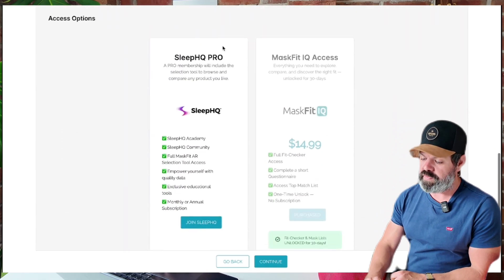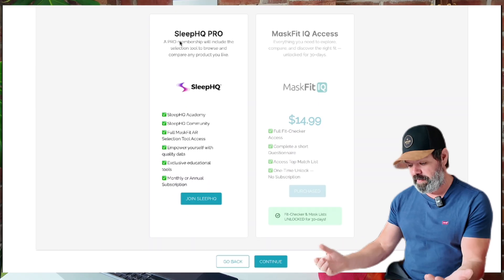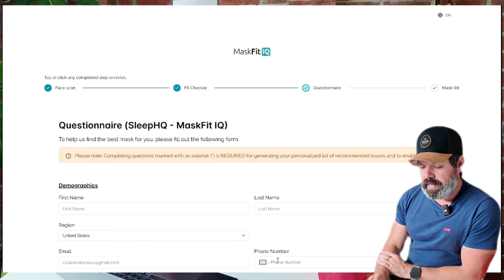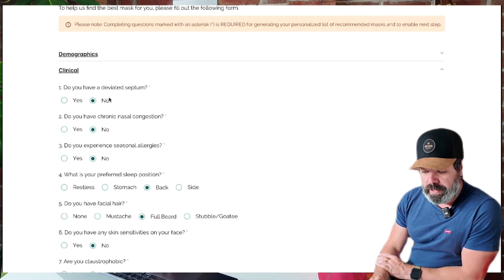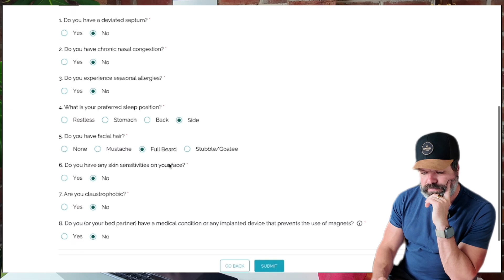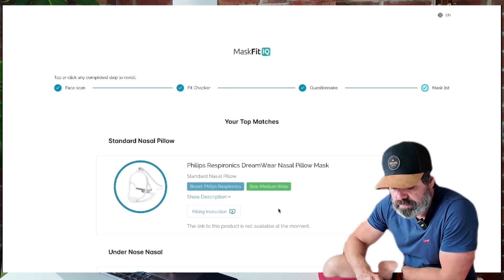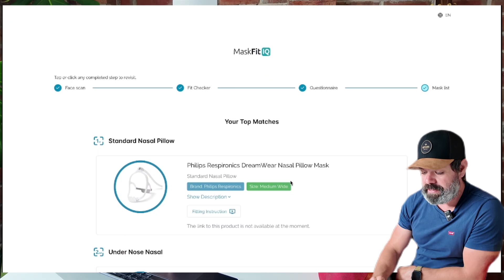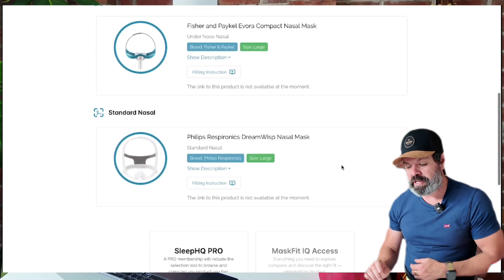If we scroll down, you can see mask fit IQ access is normally $15 for 30 days, but with a Sleep HQ Pro membership you get unlimited access forever. I'll tap continue. I can fill out a questionnaire here — do I have chronic nasal congestion? No. I sleep on my side. Full beard? No. I'll click submit. And here we have my top matches: the Philips Respironics DreamWear Nasal Pillow Mask — a top performing mask on Sleep HQ — the Fisher & Paykel Elvora, and the Philips Respironics DreamWisp Nasal Mask.